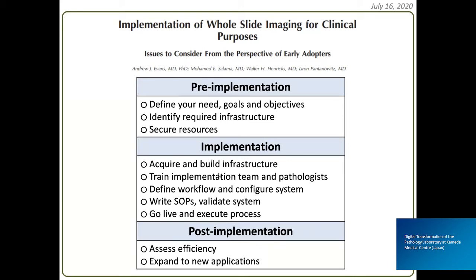When you're acquiring and building infrastructure, you train implementation team and pathologists. You define workflow and configure system, write SOPs, validate system, and finally go live and enjoy. It's not over here, because at the 3rd phase, you need to assess efficiency and probably expand to new applications.